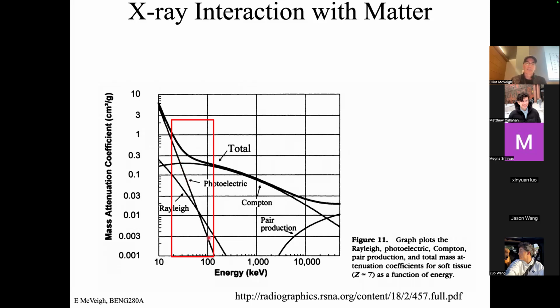As we get to higher and higher energies, and this is a log scale, remember, this thing just goes diving down, such that by the time we're at 110 keV, very little photoelectric effect is stopping X-rays. If we're down here, at 20, 30, 40 keV, we have a significant amount of photoelectric effect.